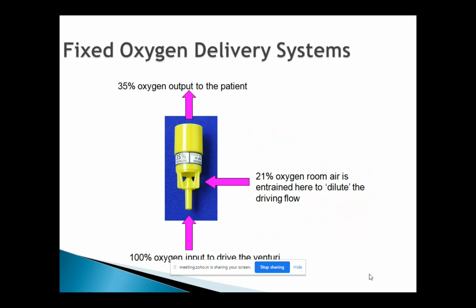So according to the manufacturer instruction, it's very clearly written, you need to set the valve to 10 liters flow. Once you give the 10 liters of oxygen at the bottom of the valve, the room air, 21%, enters the holes on the side of the valve and dilutes that 100% oxygen to 35% oxygen when it comes out. That's the reason the holes on the side of every valve are different, to provide the exact oxygen concentration. So you may say, that may not be true. How is that even possible?